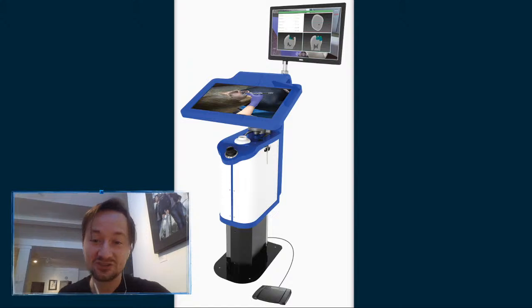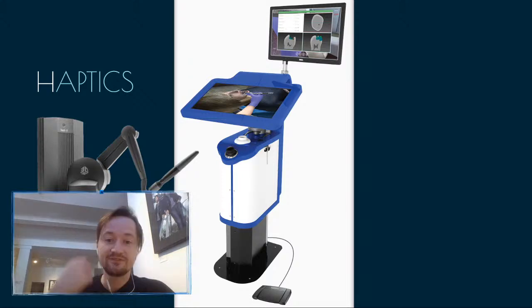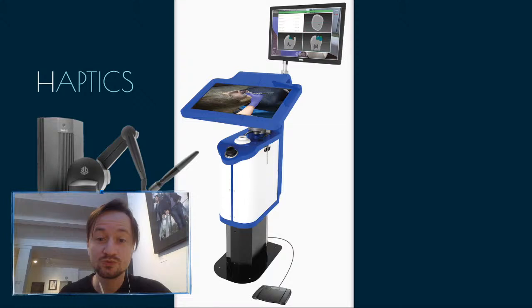You see the top screen there is tactile navigation, with 3D glasses to give you a perception of depth as you're working on it. The wow factor comes from the haptic devices here. They allow you to use the hand within the simulation, and it gives you force feedback. The whole idea is that you can give virtual treatments to virtual patients, but get the sensations that you would from a real treatment. So that's the number one wow factor when you sit down.